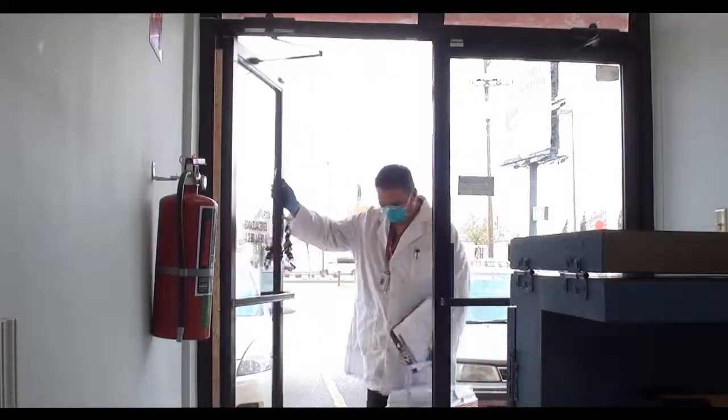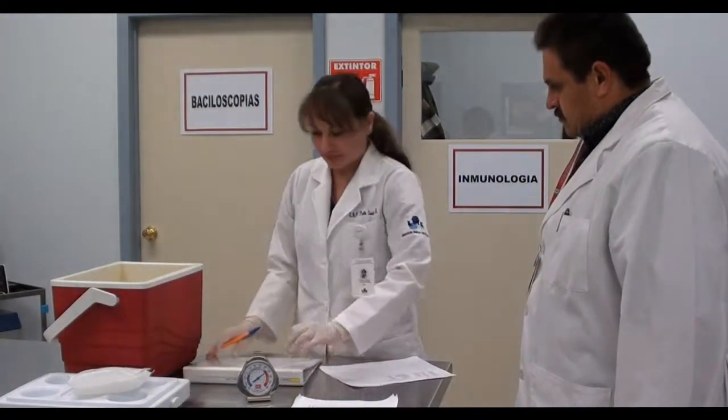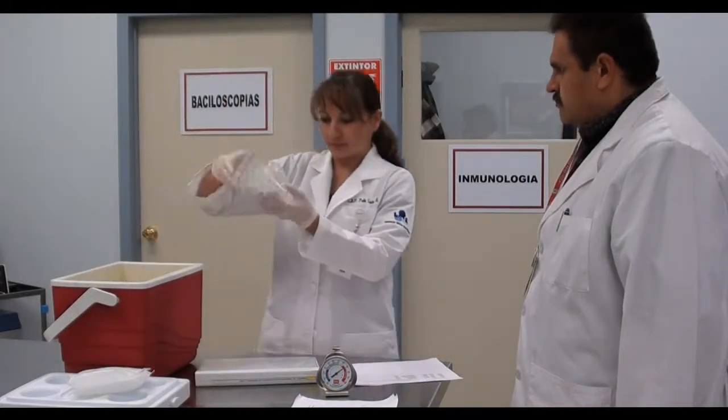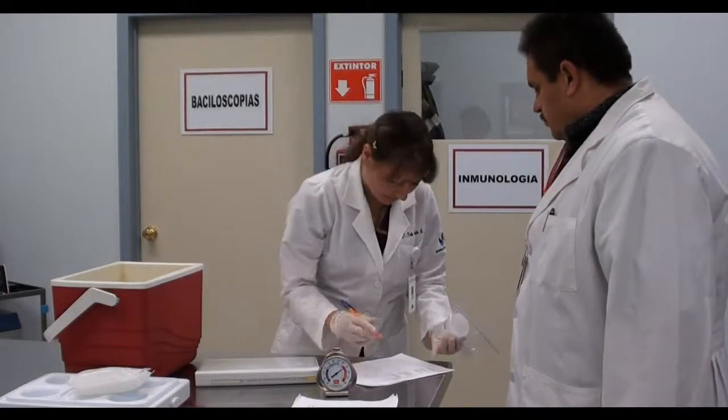Ideally, samples received by the laboratory should be processed within 24 hours. The laboratory must examine the samples. If they are not acceptable, the procedure must be repeated immediately or the following day, considering the new sample as the first of the series.